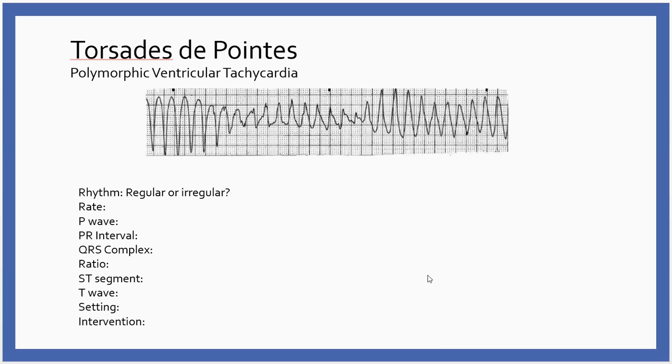And so we're just going to go ahead. Annie, are you okay? They're not responsive. Call for help. We'll go ahead and start CPR. We will shock this, so you can defibrillate this. So as soon as you can get the monitor in and get it attached, we're going to go ahead and shock.